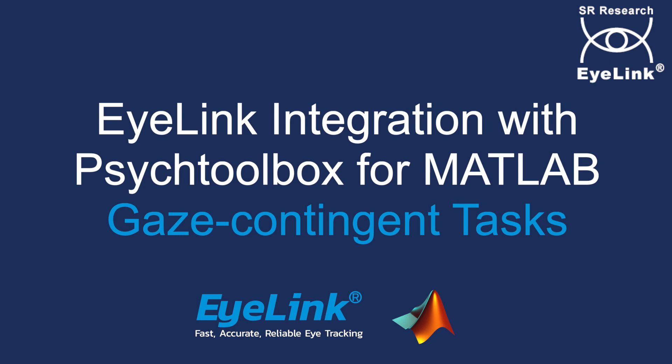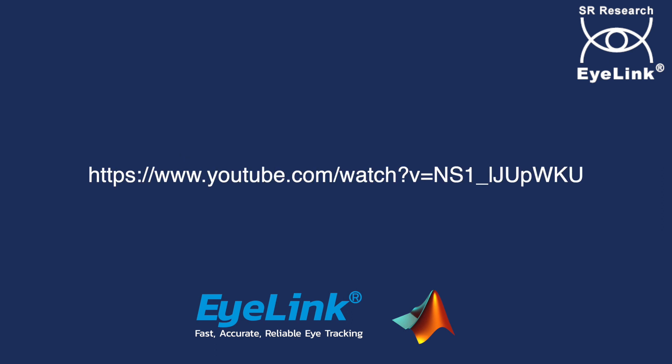This is the second tutorial on EyeLink integration with PsycToolbox for MATLAB. It is a continuation of the basic integration tutorial and assumes that you are familiar with the basic EyeLink integration with PsycToolbox. If not, you can watch the first tutorial here. In this tutorial, I will go through the steps required to create gaze-contingent tasks and show how to retrieve eye movement data online via PsycToolbox.